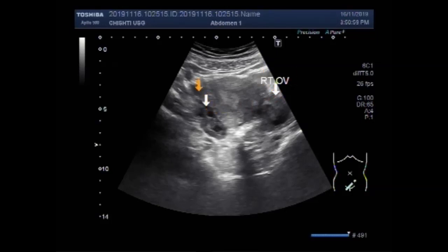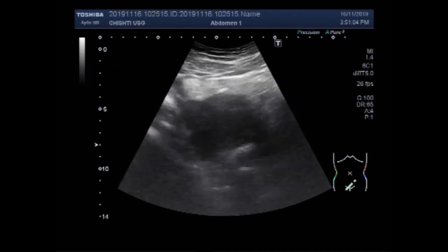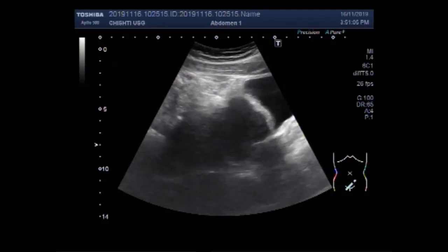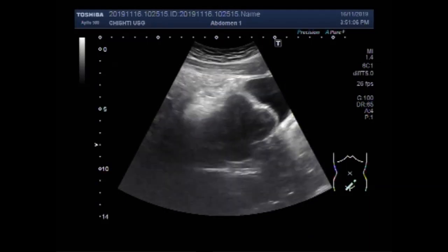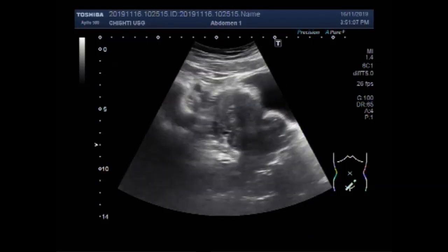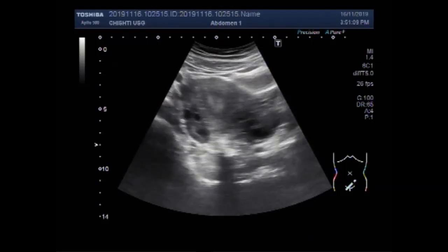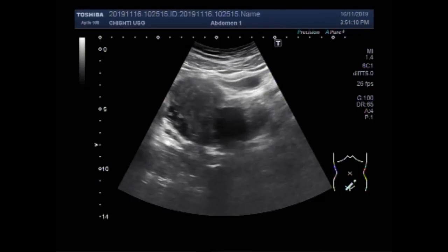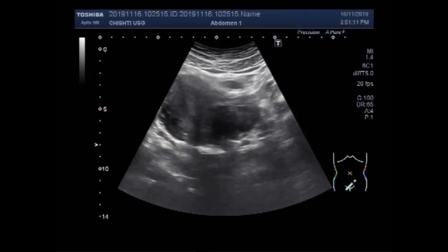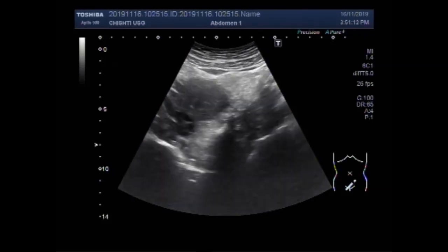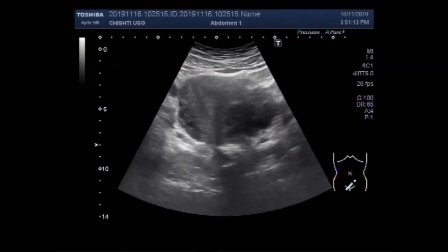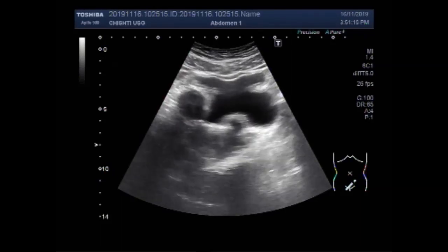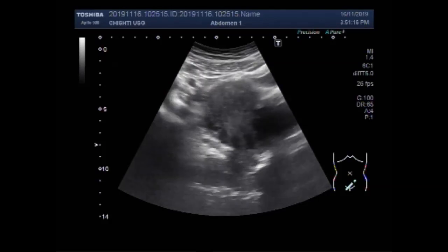According to their location in the uterus, they are called intramural fibroids, subserosal fibroids, pedunculated fibroids, and submucosal fibroids.